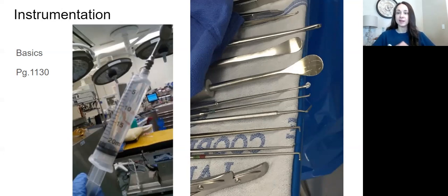And we can do a handheld crank drill, crank into the brain, to relieve pressure or whatever the emergency is. That's usually what it is, relieving intracranial pressure, the ICP. So definitely be familiar with your handheld crank drill. Don't think it's old school, we don't use it anymore. We still use that. This is typically a disposable handpiece. So you'll open this out of a sterile package, you'll use it once and you throw it away. It's not something that's sterilized and reused all the time.